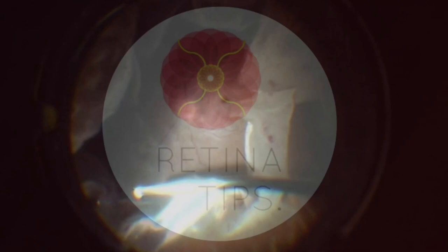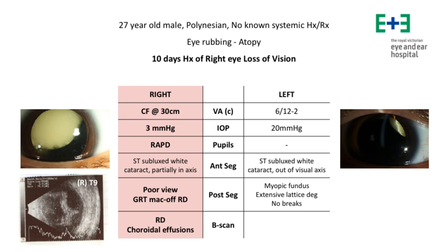This is a case shared by Dr. David Cuadero Sousa from Melbourne, Australia. This is a case of a 27-year-old male with a history of worsening visual acuity in the right eye 10 days ago.